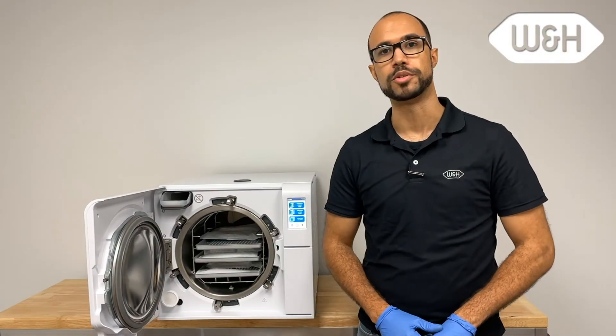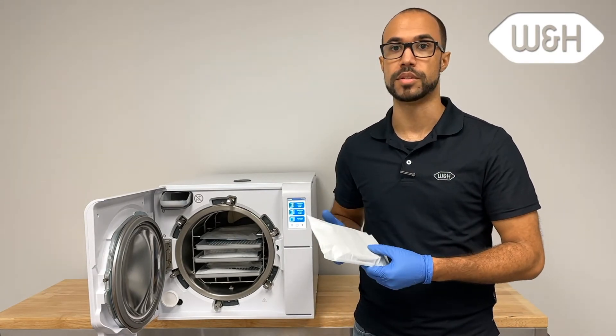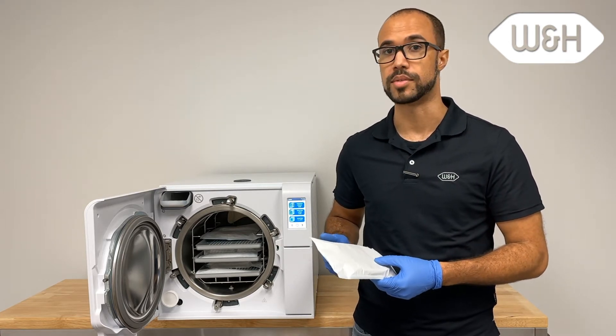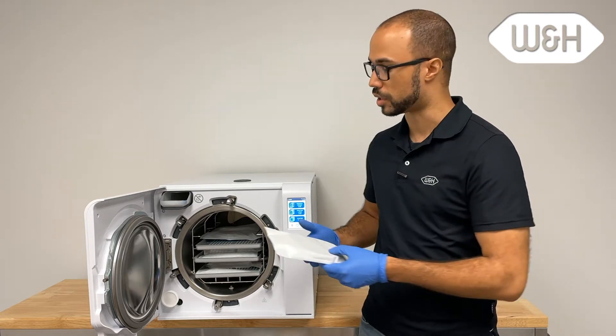When loading the pouches, it's important to load pouches paper side up. This facilitates drying during the Lexa's vacuum assisted drying cycle. It's also best practice to not overlap your pouches. Load wrapped instruments onto the tray inserts.